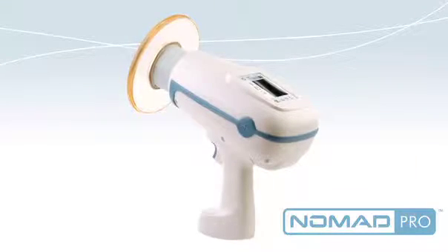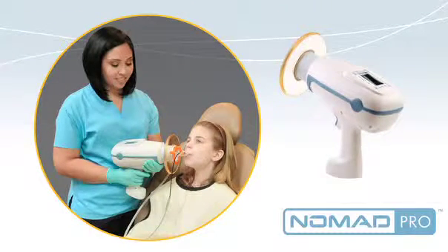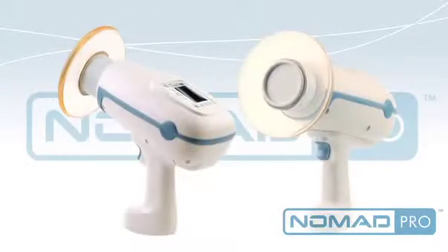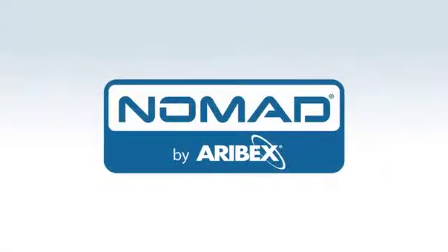Nomad Pro is convenient and cost-effective. Since it goes easily from room to room, most offices would require only two Nomad Pros for every six operatories. Nomad Pro has changed the way intraoral x-rays are taken in the modern dental office. Being off the wall is a good thing.